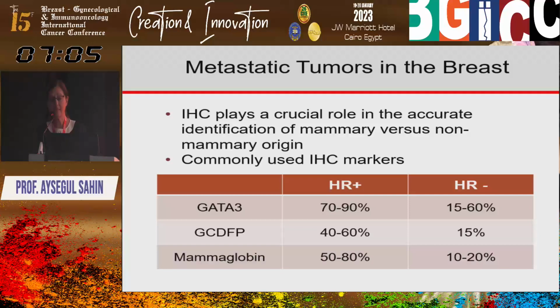So in summary, a wide variety of tumors with a wide variety of morphologic features can present in the breast. When we look at breast lesions, as I said, there are no specific morphologic features, no specific clinical or imaging features, and no specific breast marker.